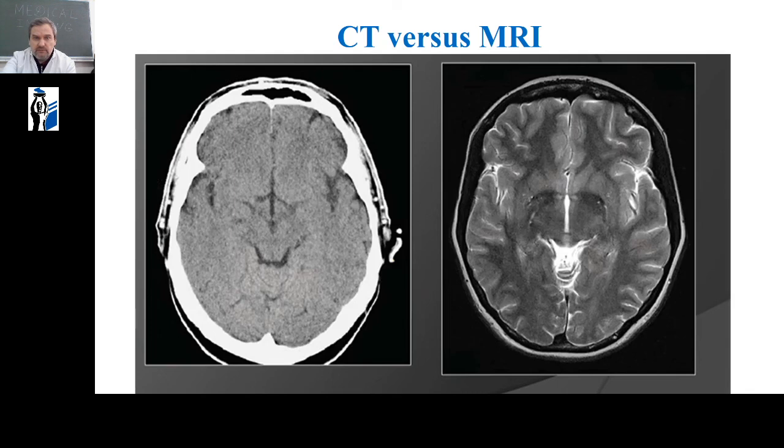As we have already understood, computed tomography is not magnetic resonance imaging. Computed tomography solves its problems and magnetic resonance imaging solves its own. These two methods overlap in cases where it is necessary to analyze in more detail the pathological component in soft tissues detected on computed tomography. The opposite situation.